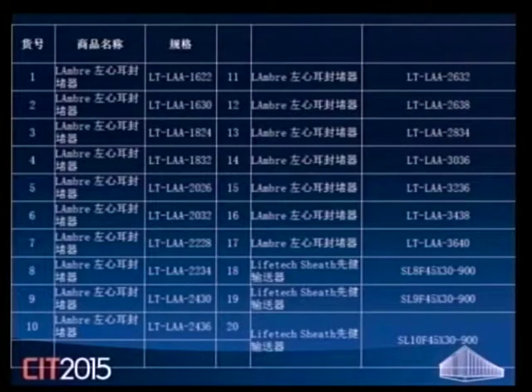In particular, if you have a cactus-like appendage, where you have in the fixation part only small and narrow space, you can choose a smaller umbrella and combine this with a bigger disc. This is one of the major limitations in complicated LAA anatomy for Watchman or for ACP or Amulet from St. Jude.